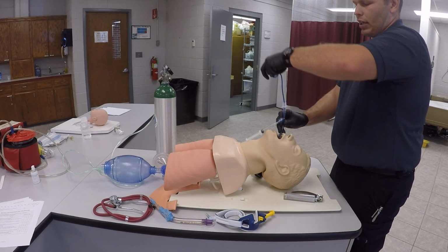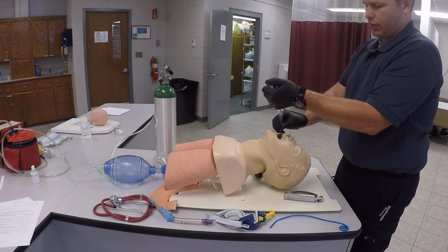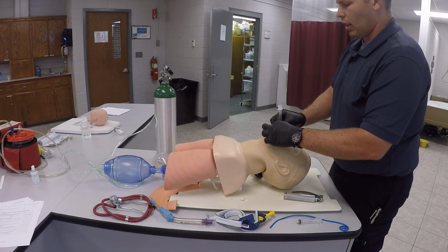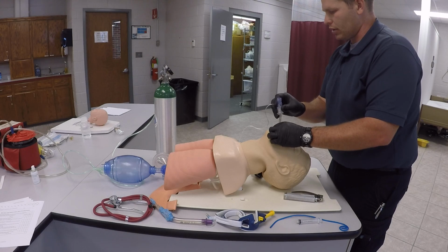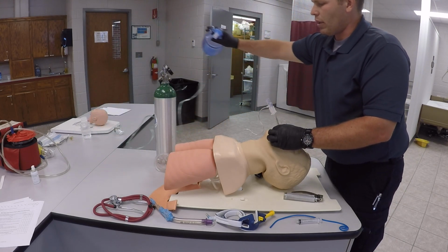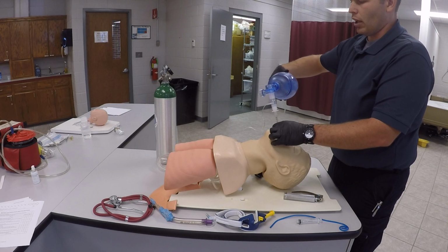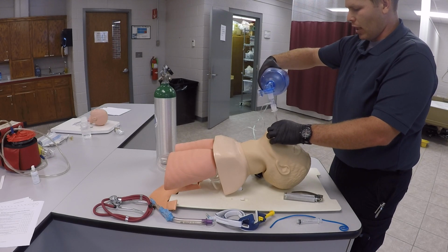Go ahead and remove our stylet. Go ahead and inflate our cuff. Make sure our cuff is nice and tight there. And then we're going to place an end-tidal CO2 on the patient, and then continue bagging the patient with high flow O2. We're going to note chest rise and fall, and then we're going to auscultate breath sounds and make sure we do have absent epigastric sounds.